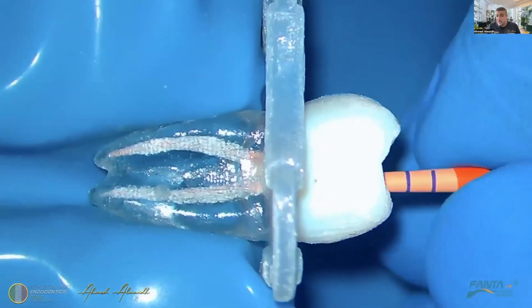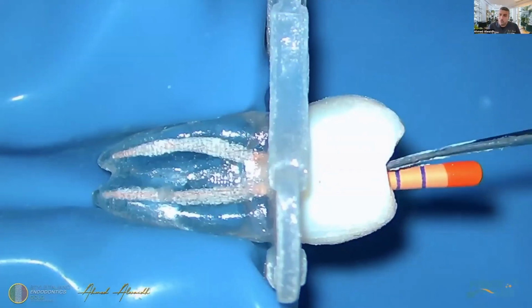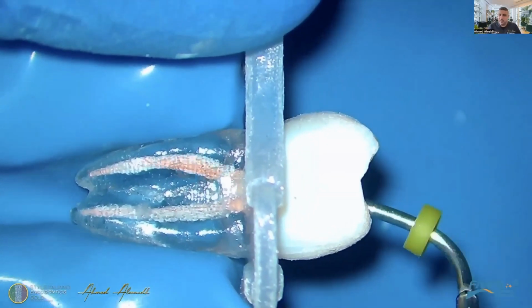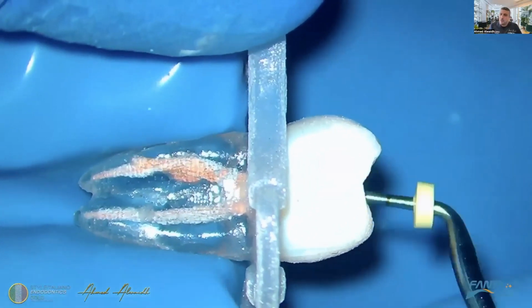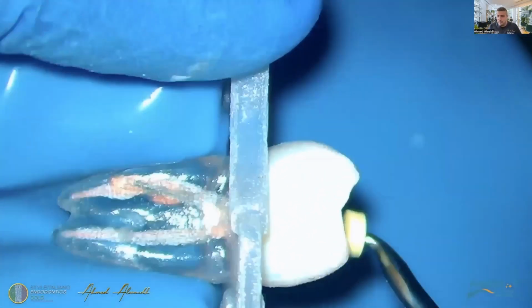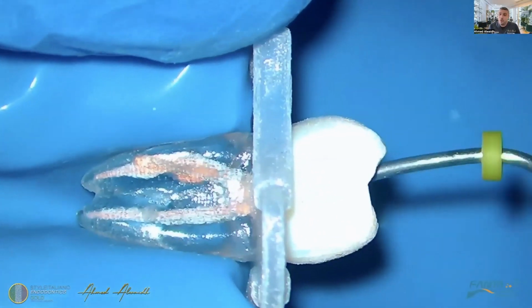But it's better not to use the same technique as you're using for continuous wave compaction. It is better to limit your temperature to 150, no more. You also don't need to go deeper, just like regular continuous wave condensation. The apical 5 millimeters to the middle of the canal is more than enough, so you can ensure the distribution of the cement.